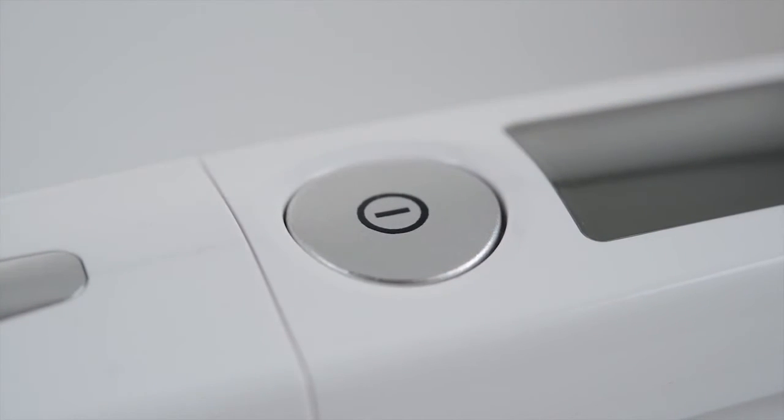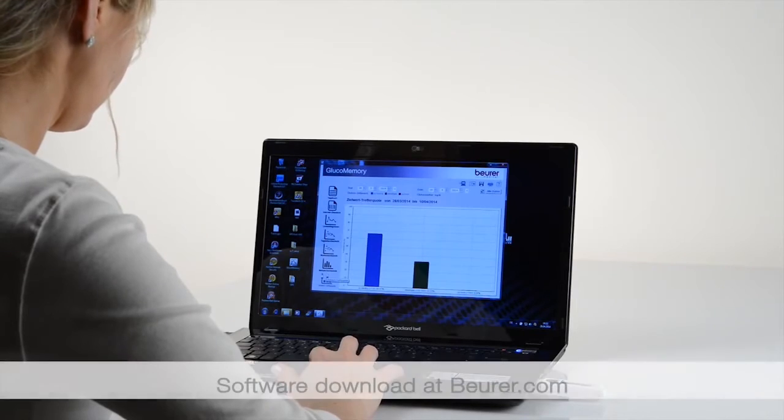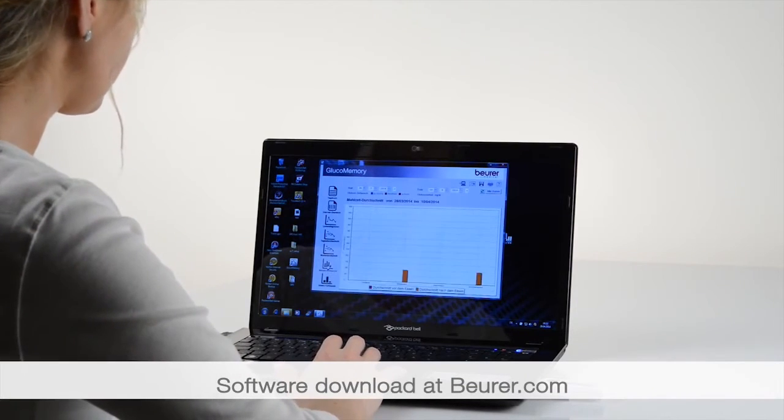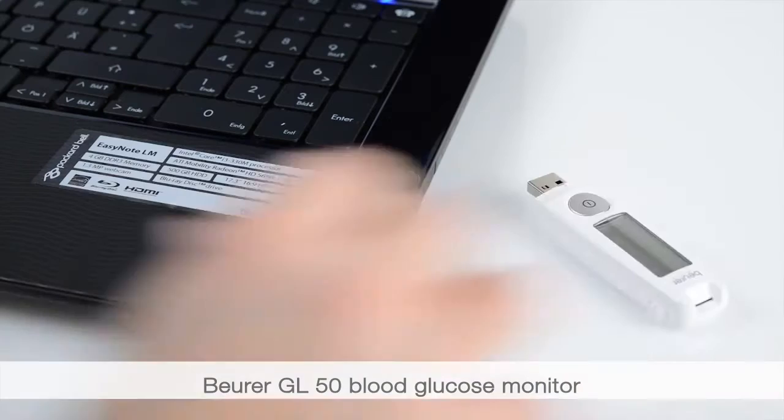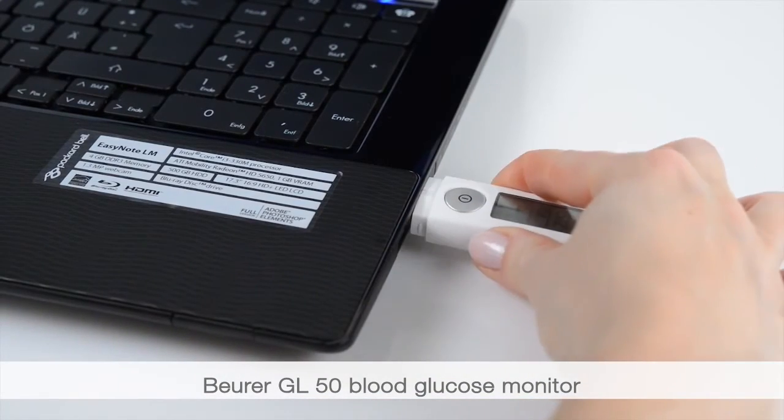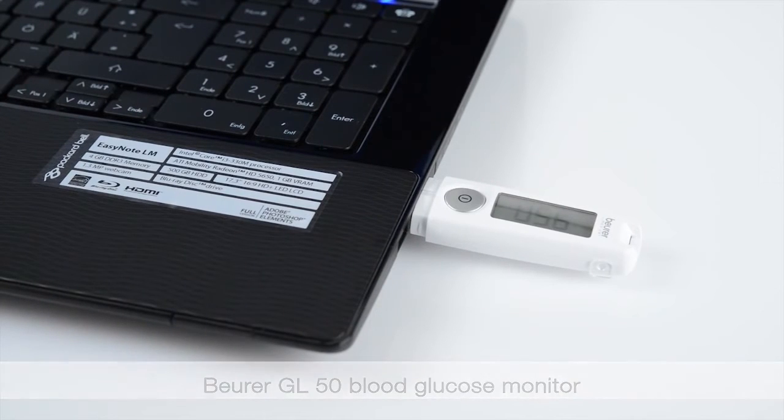You can request individual values or average values. It is possible to perform software-based analysis using the Beurer GlucoMemory or the Health Manager. For this purpose, connect to the GL50 directly.